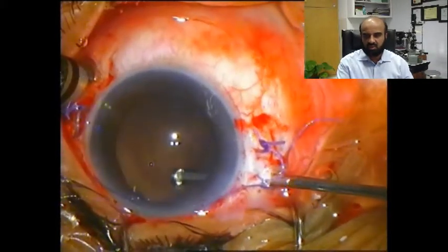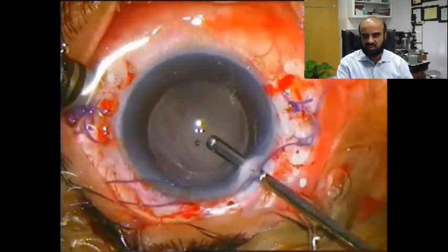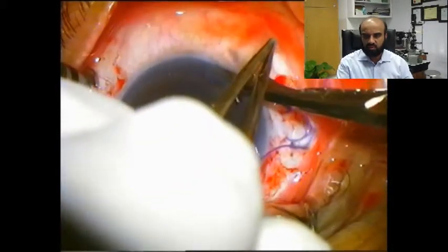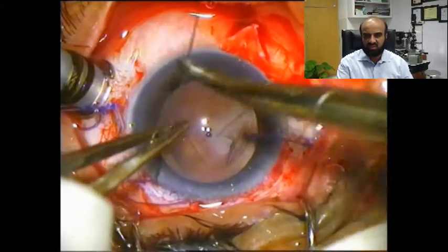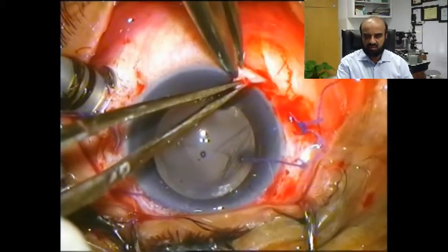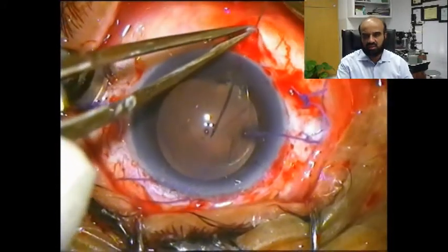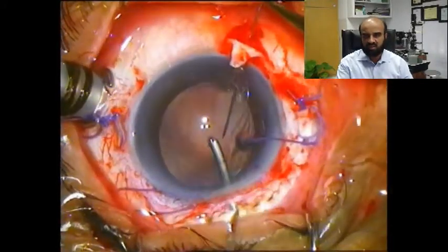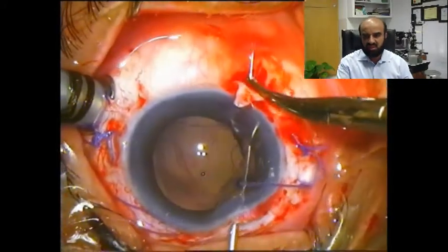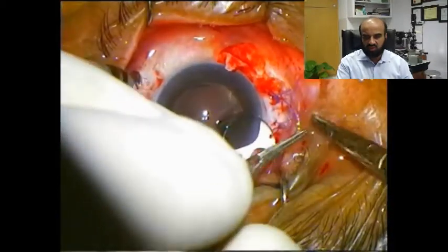Remnants of the vitreous and cortical matter are being cleared anteriorly. You can realize that superotemporally the capsule is intact, and infranasally the capsule is lacking. So we decided to fixate one of the IOL haptics infranasally. A partial-thickness scleral flap was prepared, and a straight prolene needle is passed one millimeter behind the limbus, directed towards the center of the vitreous cavity, then redirected anteriorly, and retrieved through the IOL in the ciliary sulcus with the help of a viscocannula acting as a spatula.